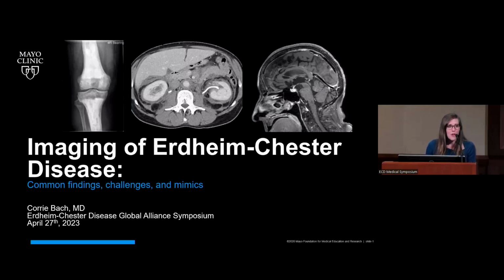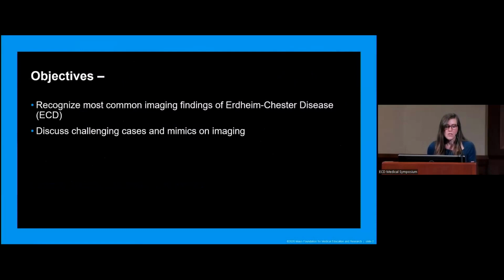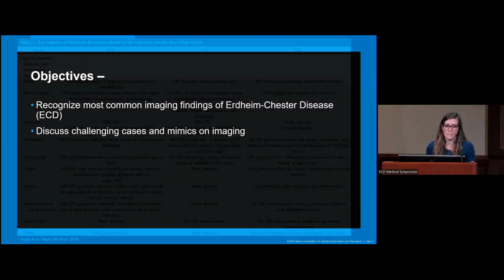I'm Corrie Bach. I'm a radiologist here at Mayo Clinic, Rochester, and I'm nuclear fellowship trained. So a lot of this talk will be focused on PET-CT. And we're going to discuss the imaging of Erdheim-Chester disease, including common findings, challenges, and mimics. So the objectives today are to recognize the most common imaging findings of ECD and also discuss challenging cases and mimics that we see on imaging.